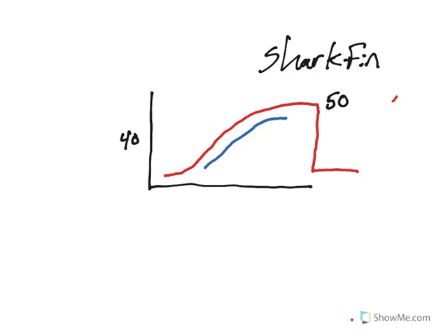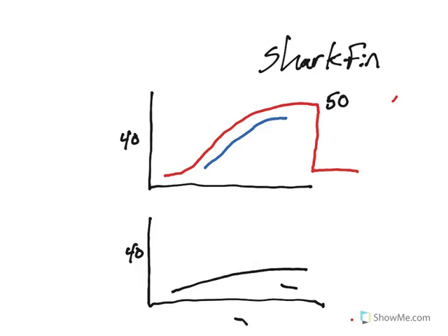But bronchospasm does not always look so well defined, and it's usually because of something that's going on in the patient. We might have a shark fin that looks more like this. And you think, well, that's not much of a shark fin. No, it's not as typical as this shark fin up here, but it still is, and it's still bronchospasm.